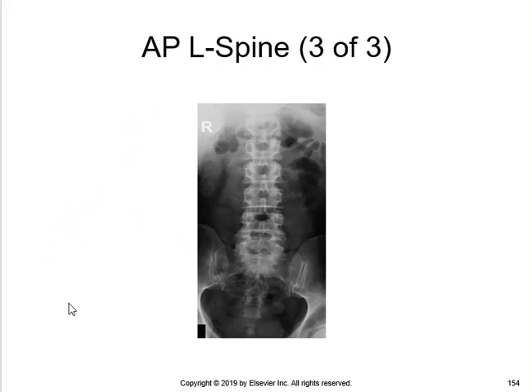So we talked about this when we were talking about wrist bones and shooting wrist bones, AP as opposed to PA. You get a better wrist with the carpal interspaces better demonstrated with the hand supinated as opposed to prone, and the wrist supinated as opposed to prone. But we just don't do them that way.